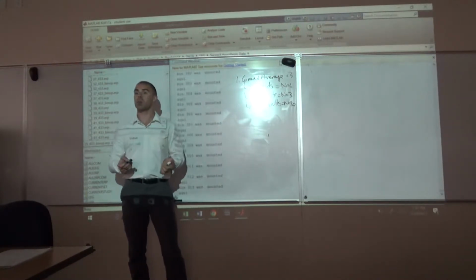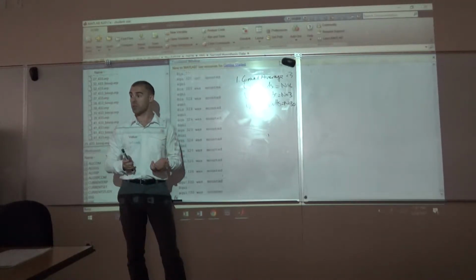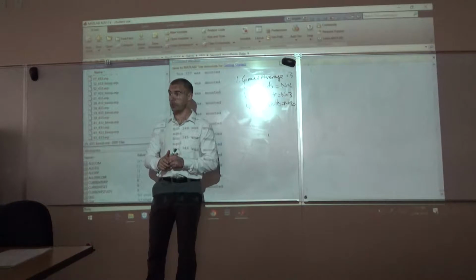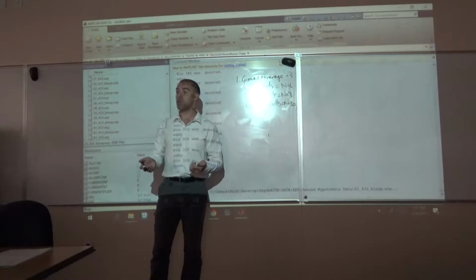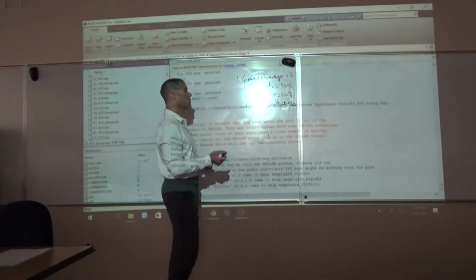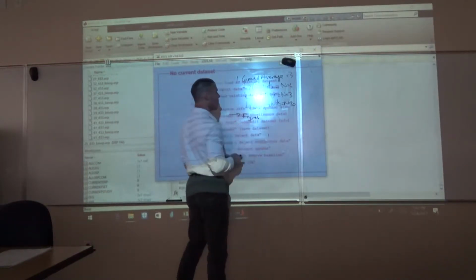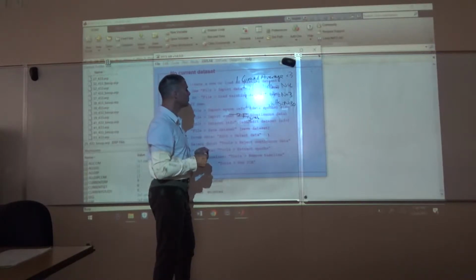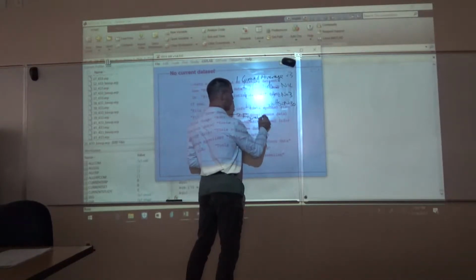The next thing that we want to do is I'll show you guys an example of how to make figures again. Would you guys like to see that? Yes. Okay, so we'll revisit that a little bit, and I'll give you an example of how I would go about making some figures. We'll do the grand averaging, then we'll do some figures. Now one thing I might do is make a figure for our controls for our sample size of 6.